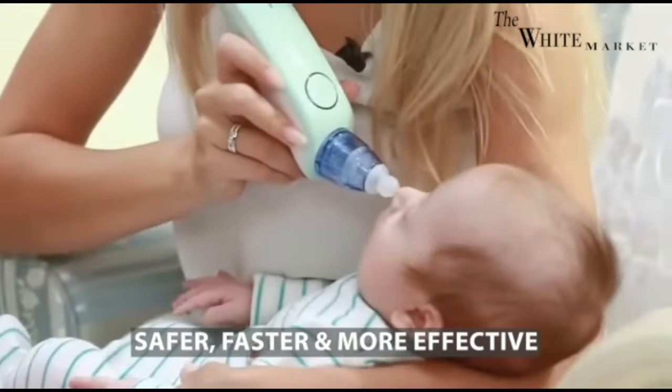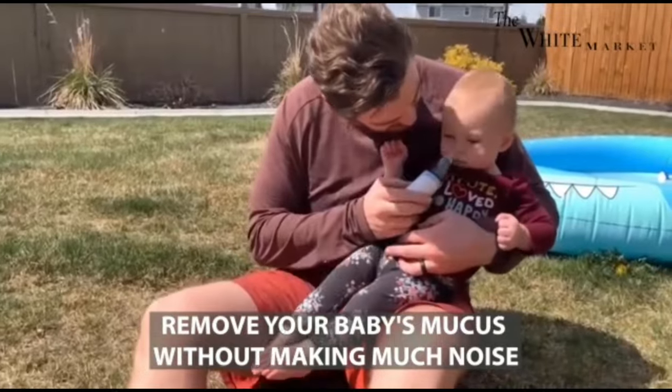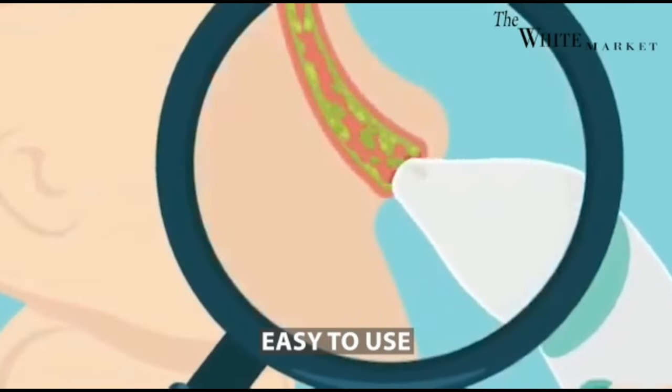To use this device, ensure your baby is in a comfortable position with their head tilted backwards. Ensure that their mouth is open so they can breathe during this process. Set your level of intensity and go ahead and get rid of that mucus so they can breathe properly again.